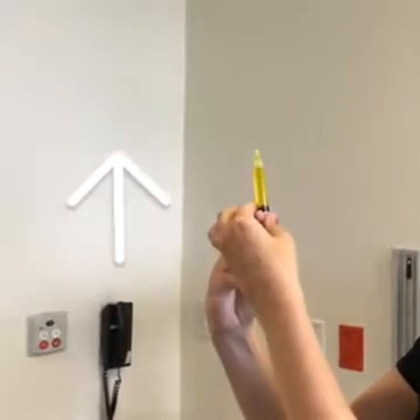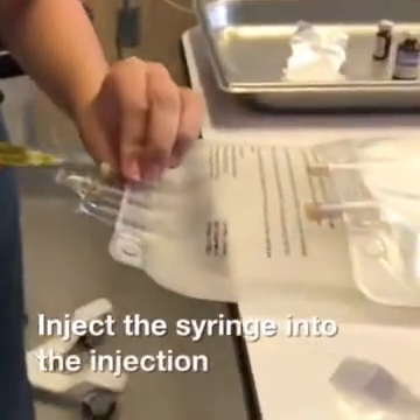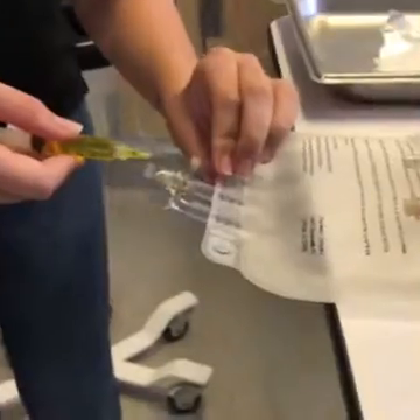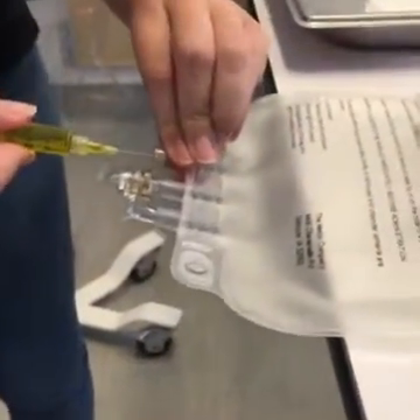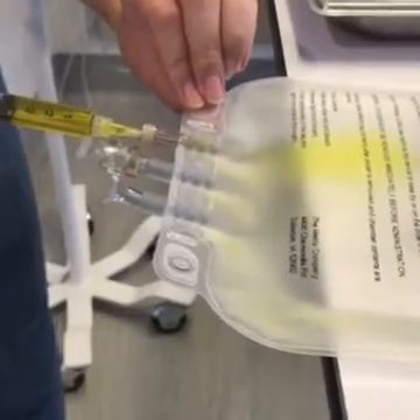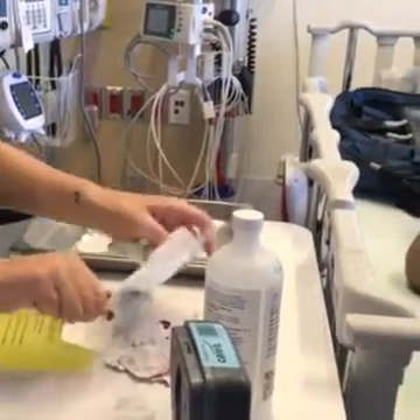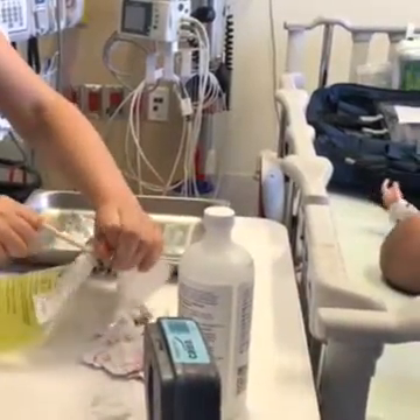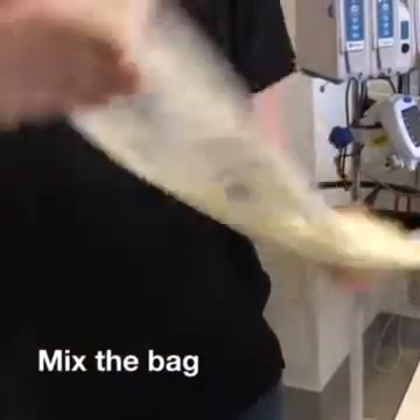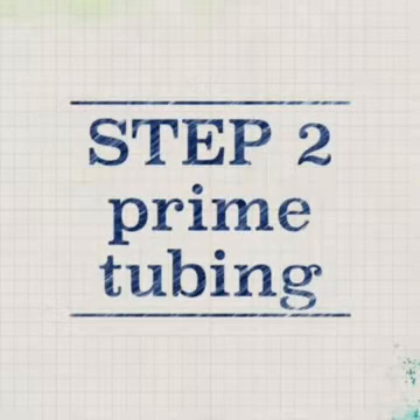Push up on the plunger to remove all of the air bubbles. Inject the syringe into the injection port — go straight in and take special care not to puncture the side of the port. Pull the separation bar tab off the PN bag and mix the bag well. Step 2: let's prime the tubing.